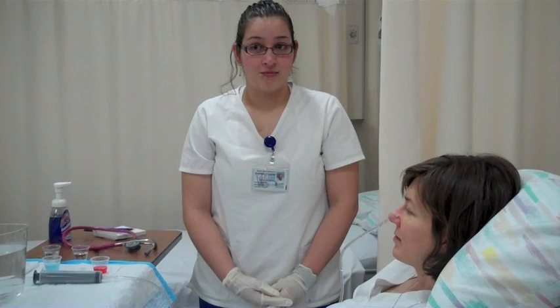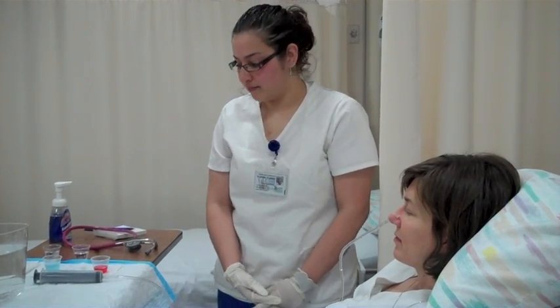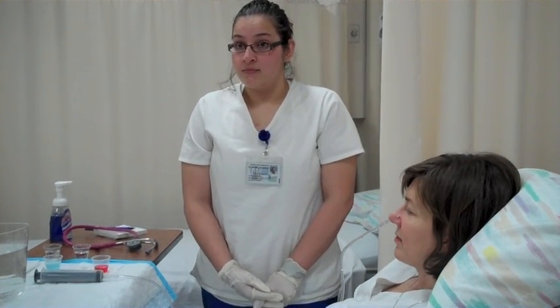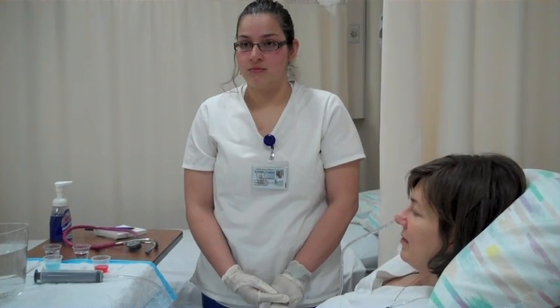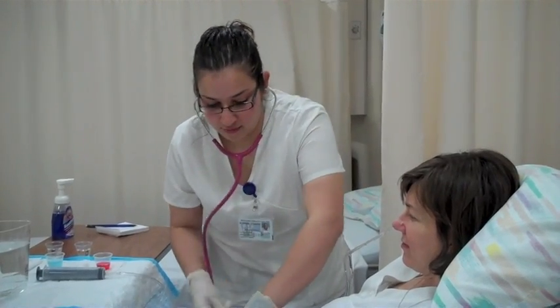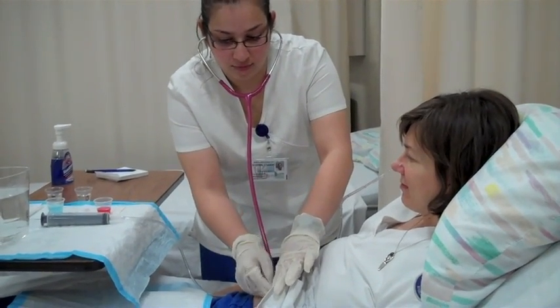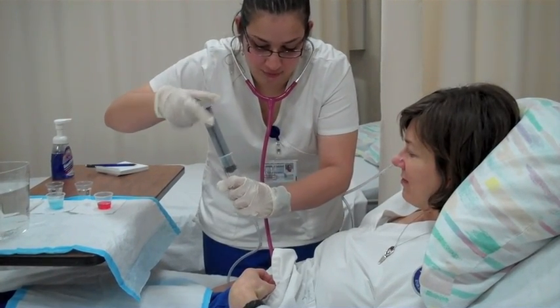Another method is to aspirate the stomach contents and check the pH. It should be less than 5.5. The definitive way to confirm placement is by X-ray. One other method that is commonly used, called the whooshing method: a stethoscope is placed over the stomach area, a small amount of air is injected through the tube, and a whooshing sound is heard.